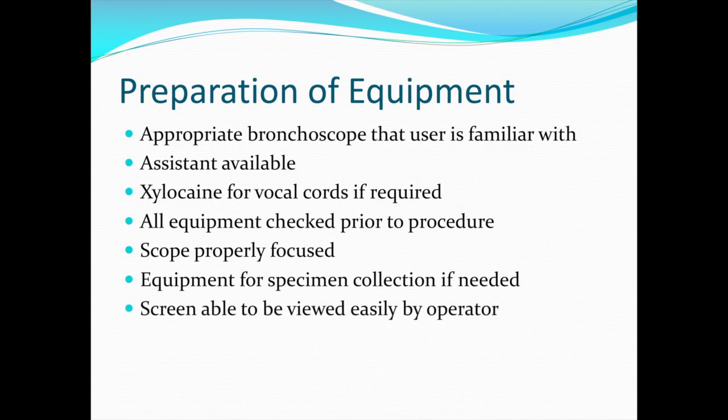Set up your screen so that it is easily viewed by the operator. And ensure that you have suction available to clear any debris or blood or vomitus that may be in the airway.